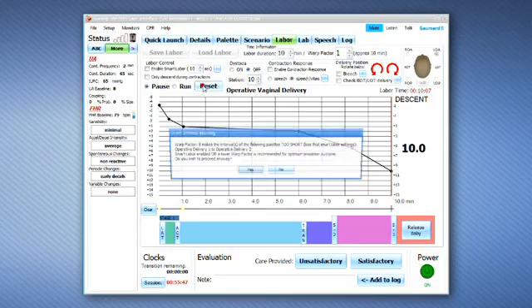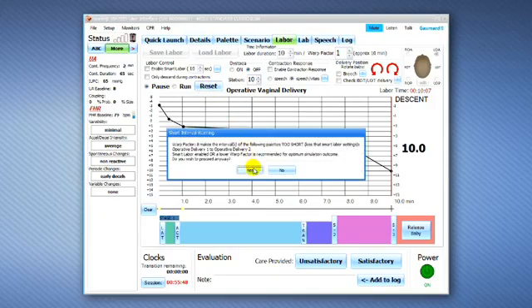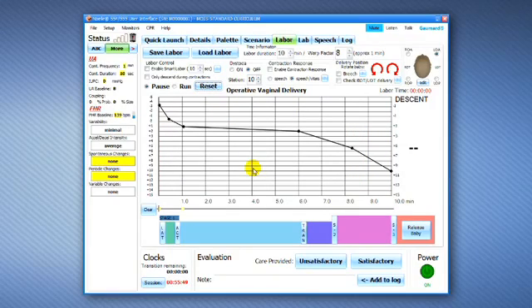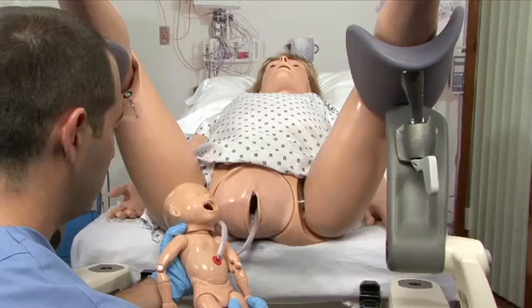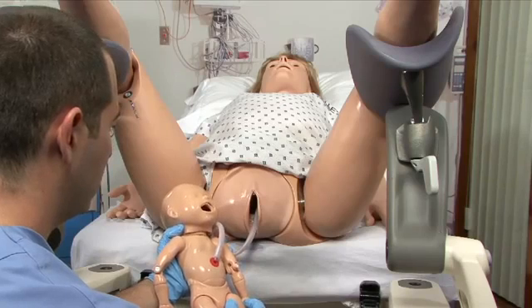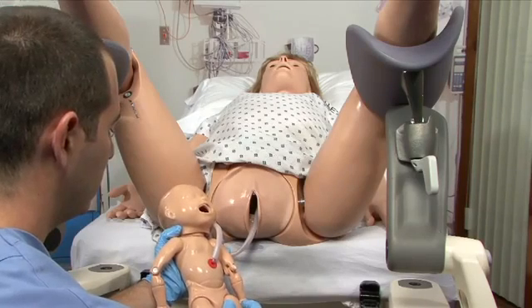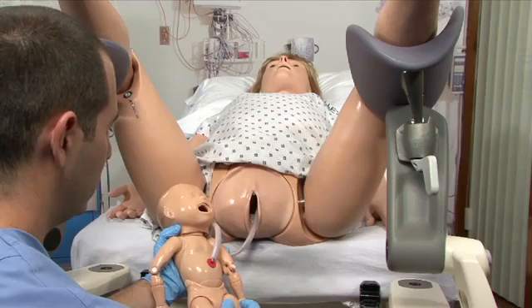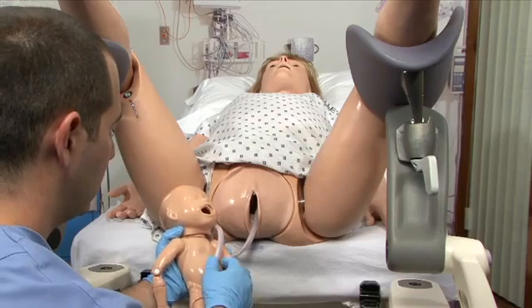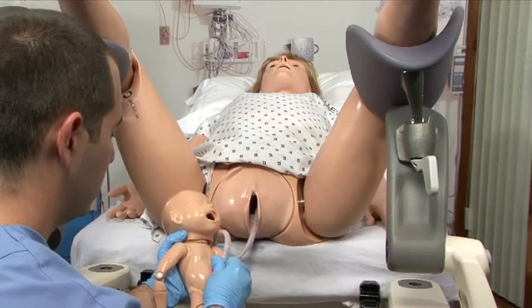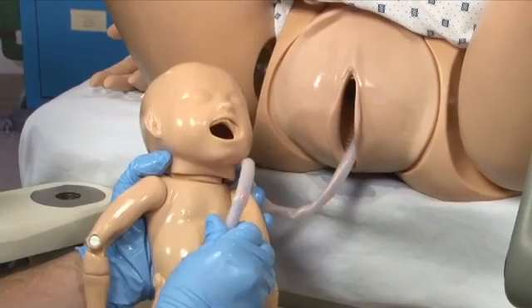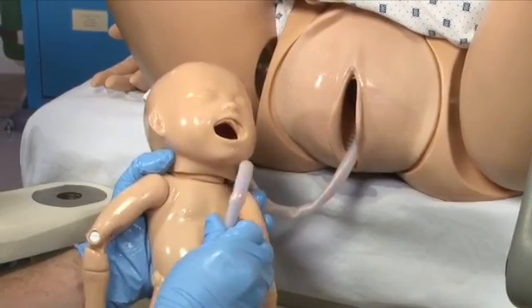Once the fetus is delivered, click the Reset button to retract the birthing mechanism back to the starting position. Once the birthing mechanism is fully retracted, retrieve the placenta and check for retained cotyledons.